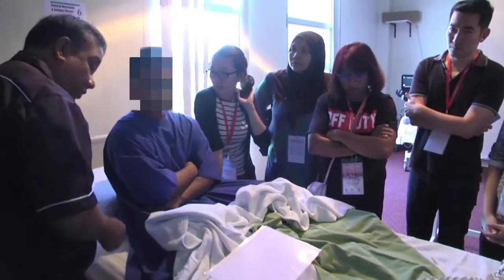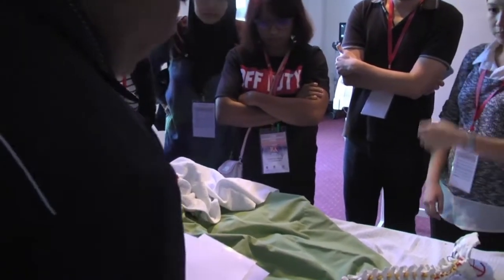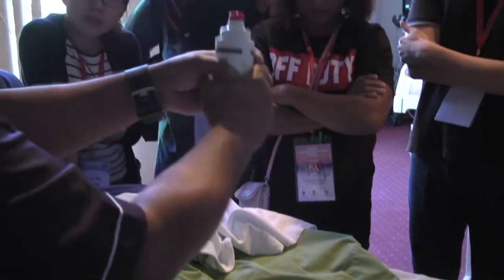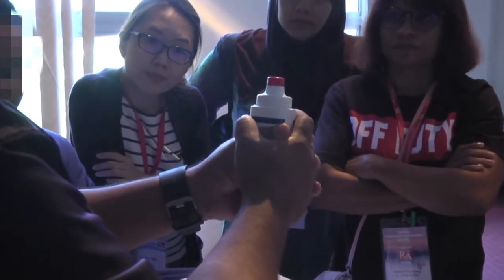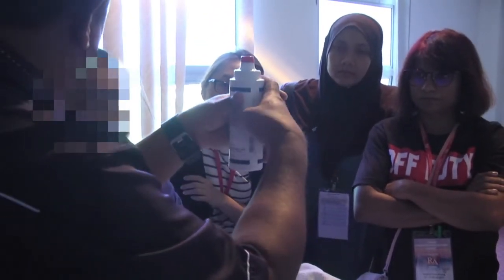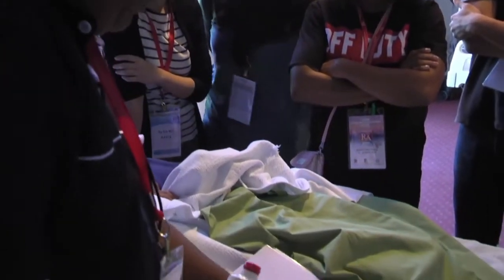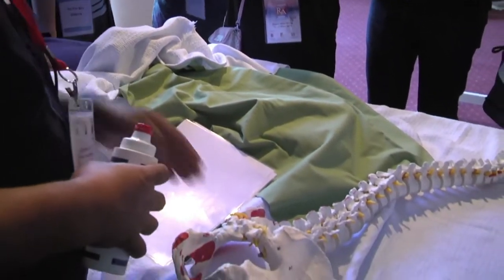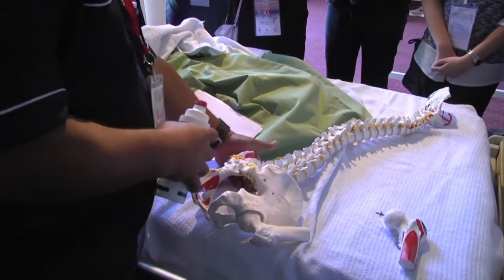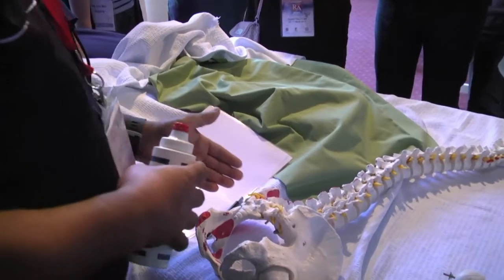Two is, I'd like you to think about this as the dural sac. If this were the dural sac, running through the spinal canal, it's wrapped around by bone. The only way you can see this neuraxial structure is if you know where the openings are. Bone per se is impervious to ultrasound. Ultrasound will strike it and get reflected back, so you would get a very bright structure and then an acoustic shadow. Whenever you see bone, it's kind of your friend because you know that it's there.